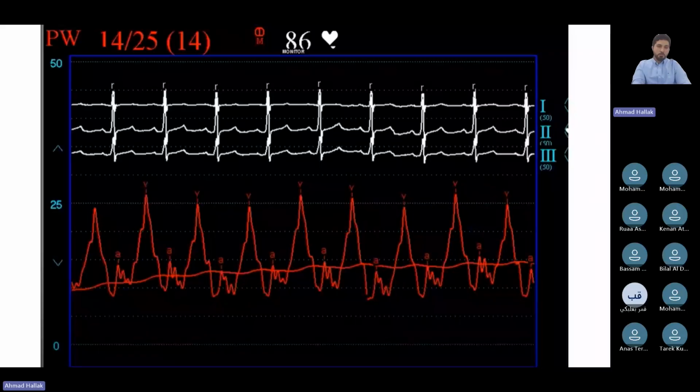So if you see a wedge pressure like this, which number do you report? Do you report the wedge pressure? Do you report the end diastolic pressure? Or do you report the peak V wave? And really what you want to do is actually report all three of them. So you report the peak of the V wave, you report the mean pressure, and you report the end diastolic pressure, because each one of these, depending on the scenario, is important for something else.